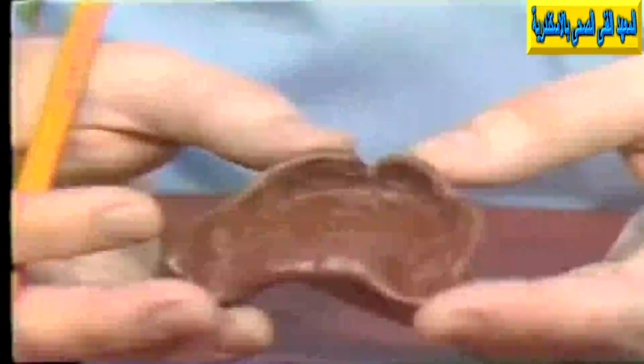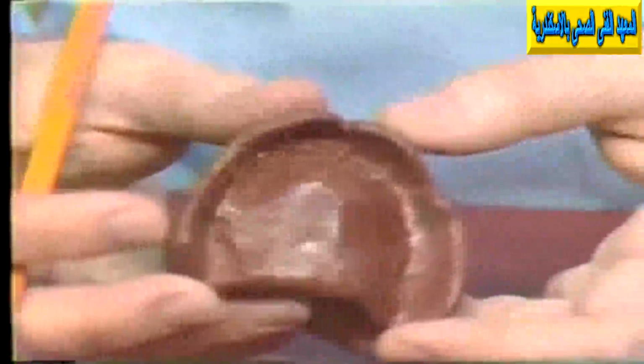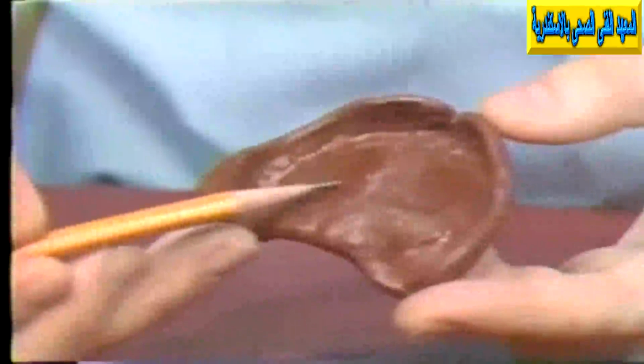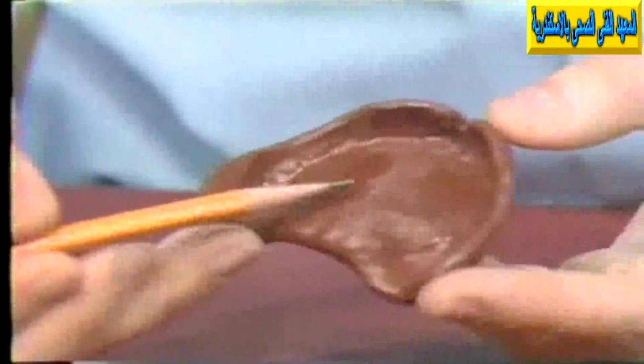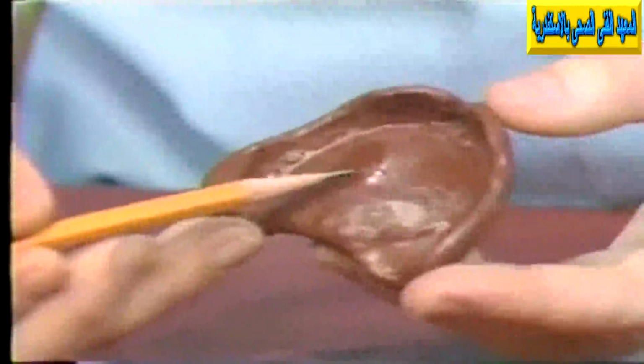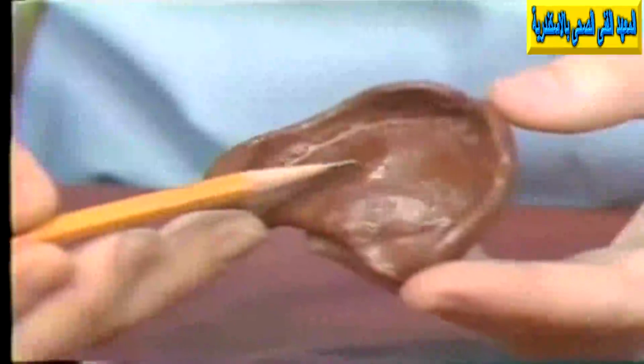Now, what I have in my hand is something similar to what you ended up with in the first exercise. It is actually a compound preliminary tray, impression or tray. And in the clinical situation, we go back to the mouth with the final impression material and make a final impression in this. So we will consider this morning and in your exercise as the final impression. And from this we will make a master cast.